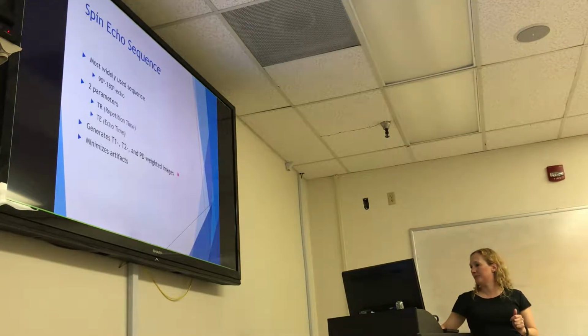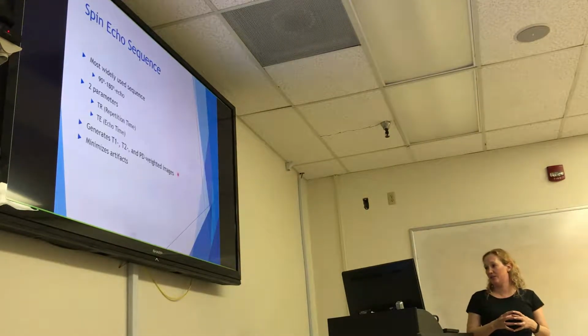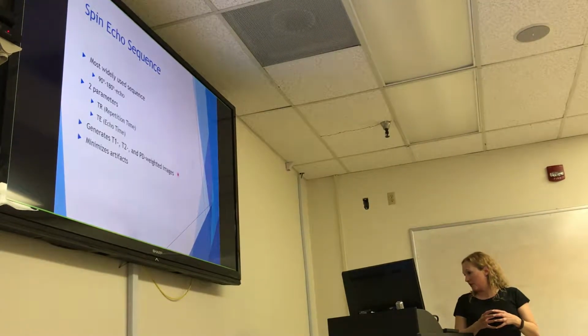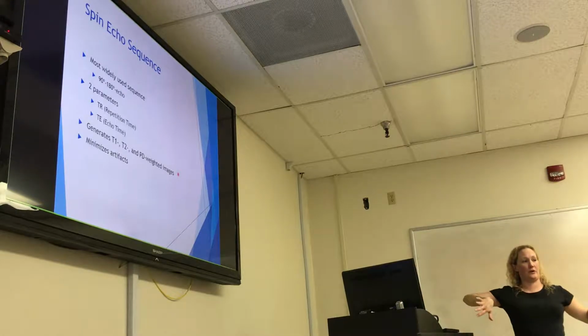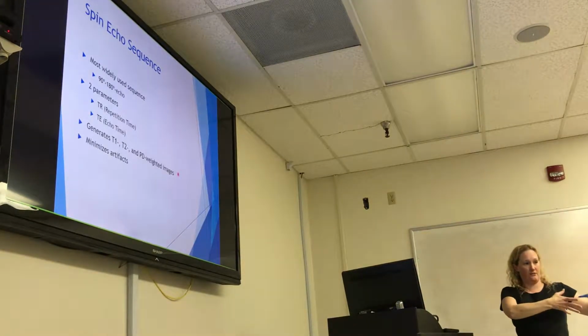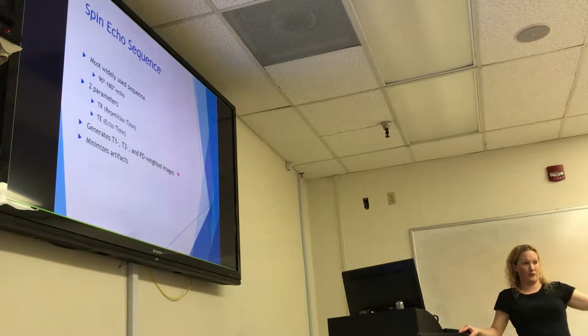Okay. So a question from the homework. We're going to talk about our spin echo sequence here. If I understand, using spin and gradient imaging captures images quicker but lesser image quality. Okay, so those are two separate kinds of sequences, okay? So we have spin echo sequences and we have gradient echo sequences. And gradient echo is for next quarter, okay?